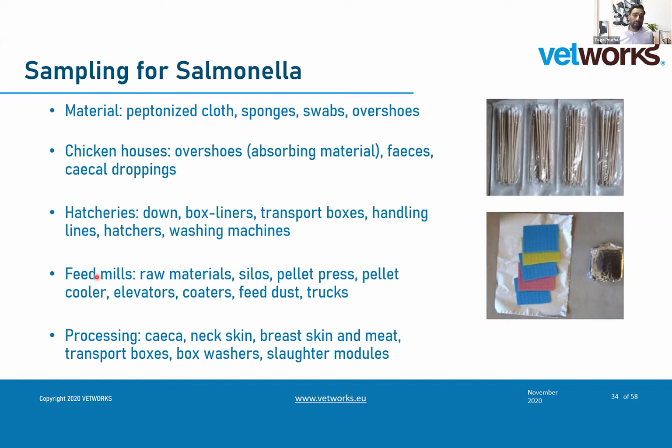And then at the hatchery, also several things: box liners, but also ventilation. I will show you in a bit a checklist of things that you can sample, also for cleaning and disinfection, things that we should look at when we are searching for Salmonella.